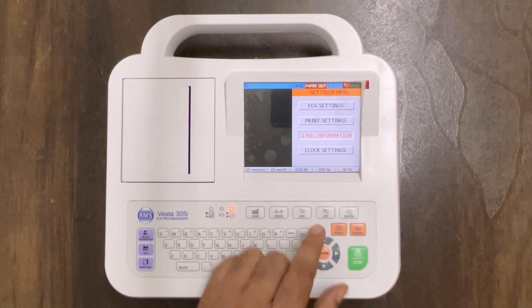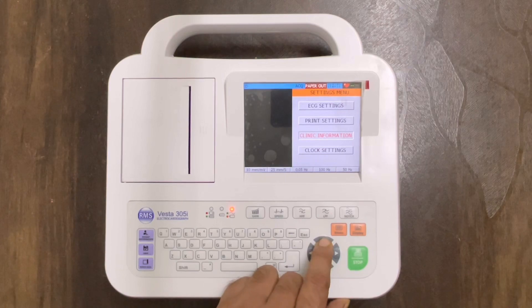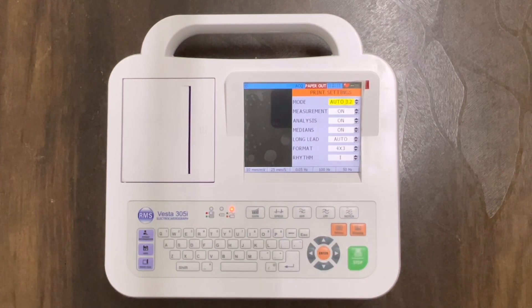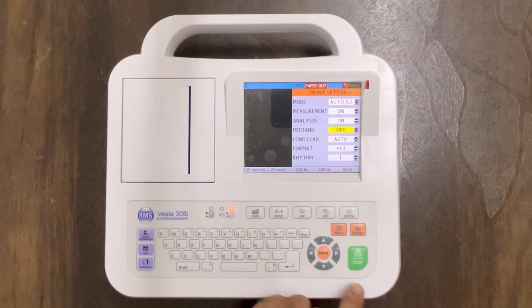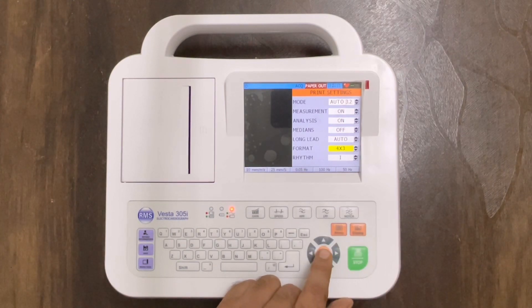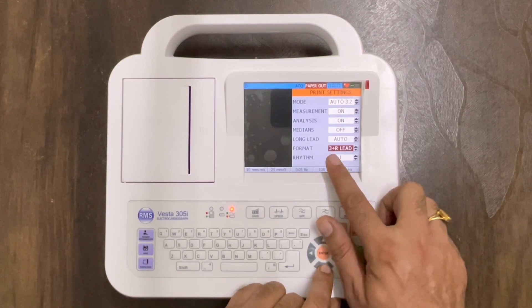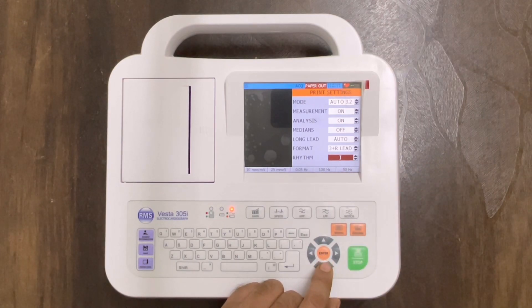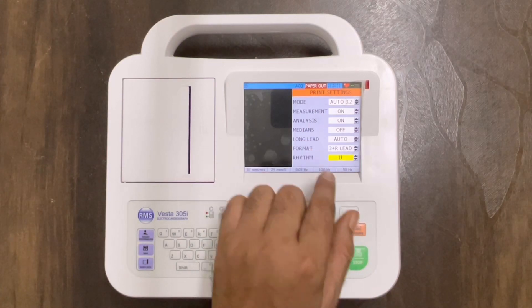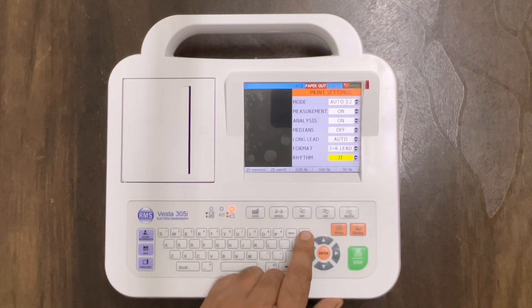Now we have to make important print settings. Go to print settings and press enter. There is a mode for measurement and medians — medians we can make off, as it is usually not required. For format, we can change it to 3 plus rhythm lead or select any one. Then select any rhythm lead such as first, second, or any one. Press enter, and once all is set, press escape.